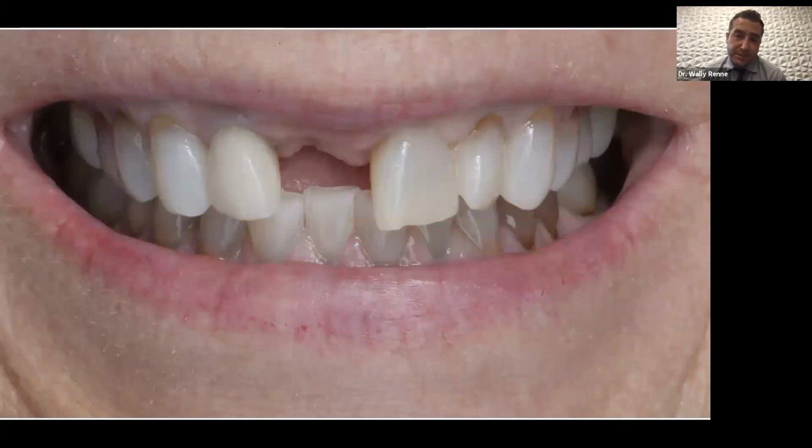So this patient presented to me, and they are on chemotherapy. They're not able to get an implant right now, and they wanted to do something conservative, restoratively. They didn't want something removable. So I'm like, okay, no problem. I'll just mill out a pontic with a wing and do a Maryland bridge or a resin retained fixed partial denture, if you will. And I did, and I bonded it in, I looked at it and I said, oh man, I did not pick up that there's a little bit of a tooth size discrepancy between that space and tooth number 9. And I feel kind of bad about it.